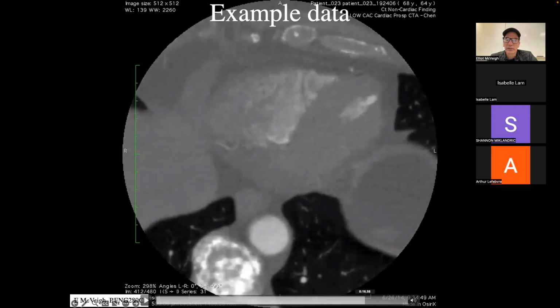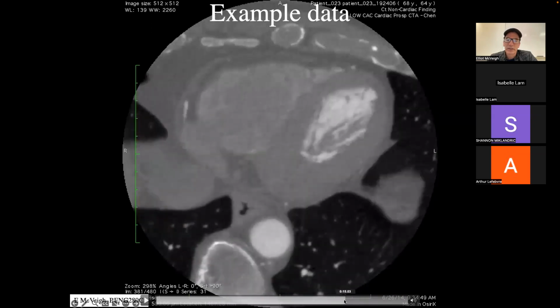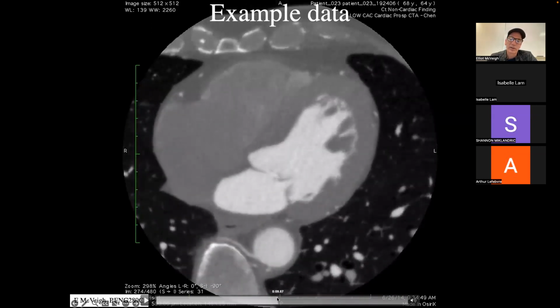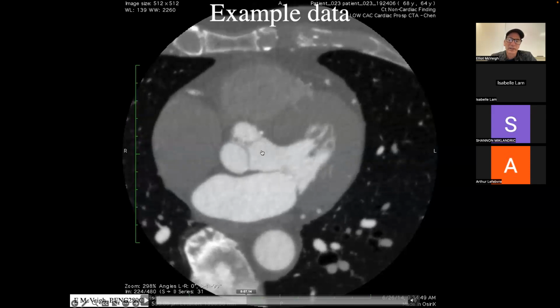centimeter field of view. So we go right from this is the apex of the left ventricle here. And as we move towards the patient's head, moving up through the heart to the mitral valve and the left atrium is here. This is the left ventricle. It's going to eject the blood out this pathway, which is the aortic outflow tract, which is right here, right? And then here's the aortic valve.